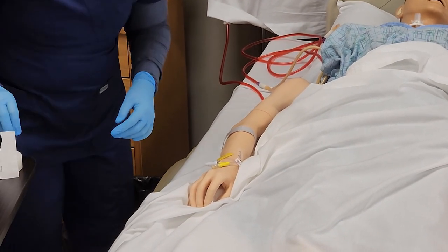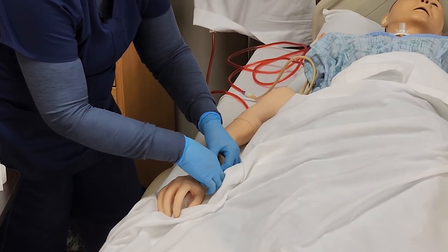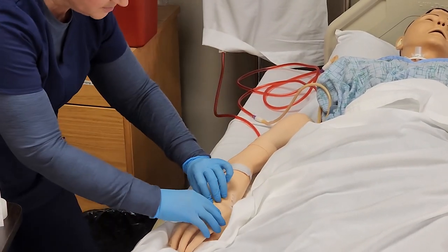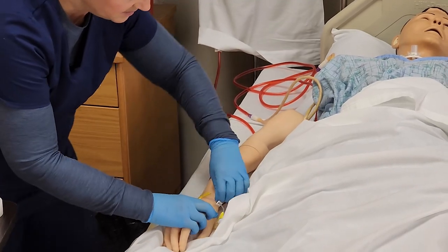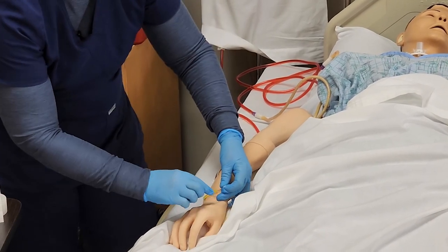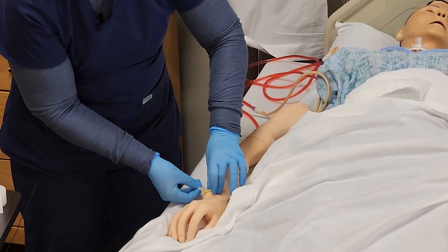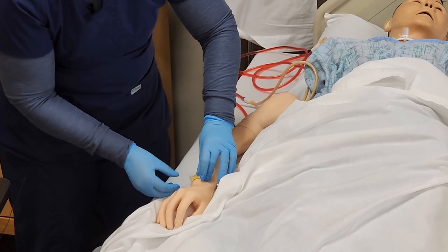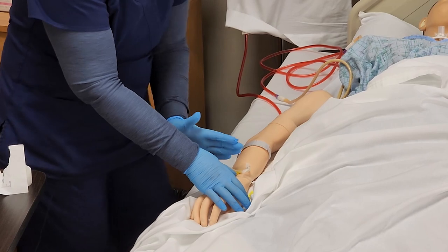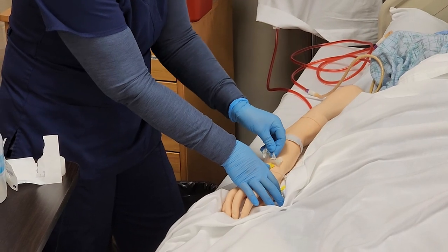Now I have to work on pulling off the adhesive. I'm going to loosen the edges — sometimes they're pretty sticky, and you could use an adhesive remover if needed. As you're removing it, secure the IV catheter. Once I've loosened it, I want to make sure I'm pulling the dressing off in the same direction the IV is inserted. If you go against the direction, you risk pulling it out prematurely.